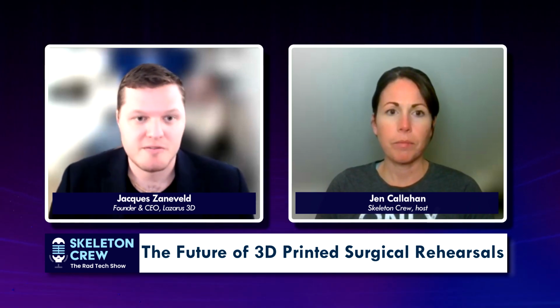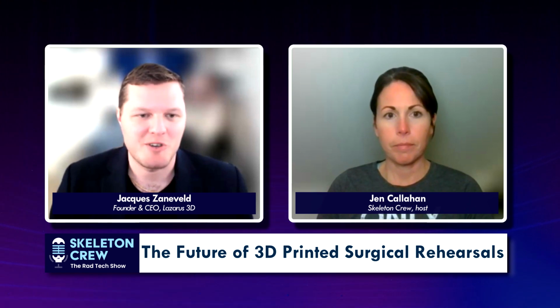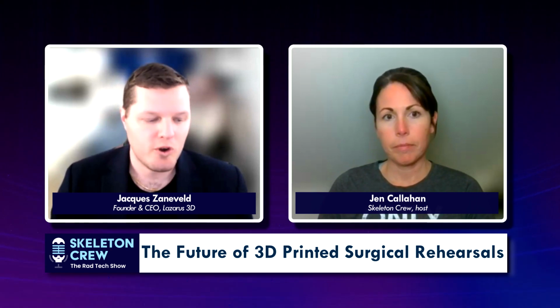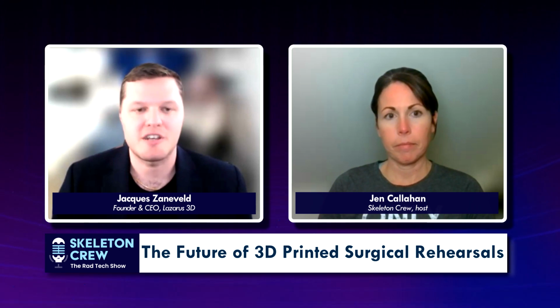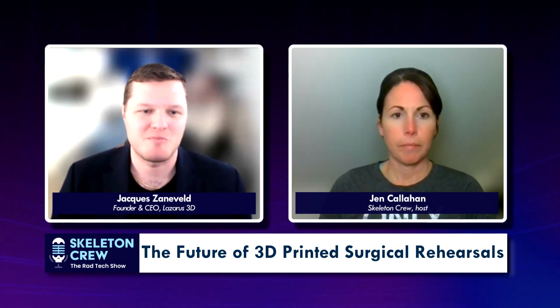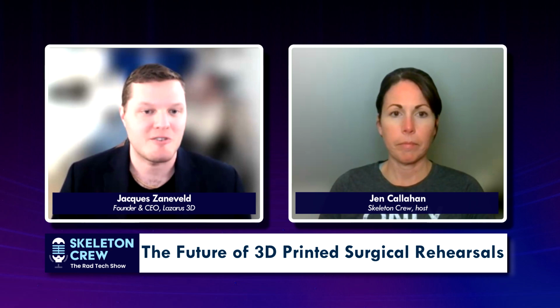Absolutely. Well, we defer to physician judgment, of course, on where and when this technology would be most effective. In my opinion, it's most helpful when there are complex cases or when there are practitioners involved that are still on the learning curve for that new technique or technology. If something is very standard, very run of the mill, I would not encourage people to use this technology. It's likely an unnecessary step. But anytime there's a challenge that we're looking at, that's where we would love to offer to help.